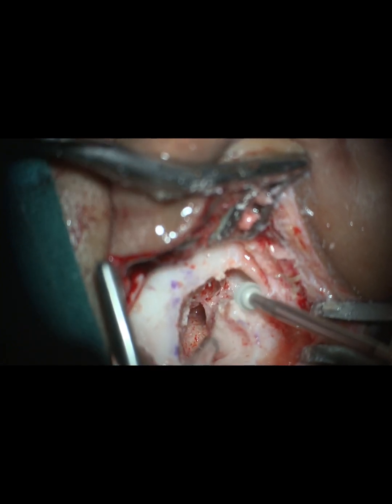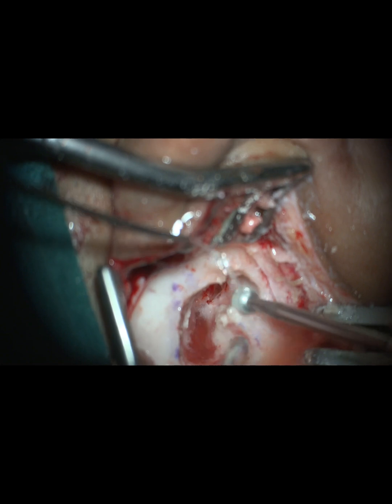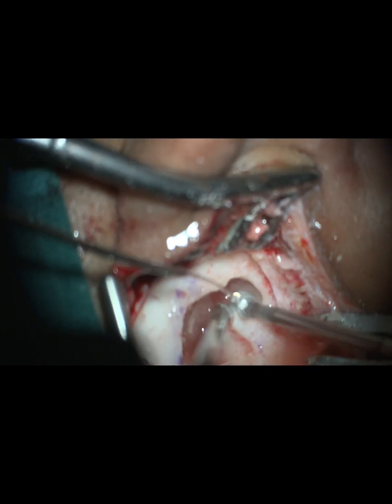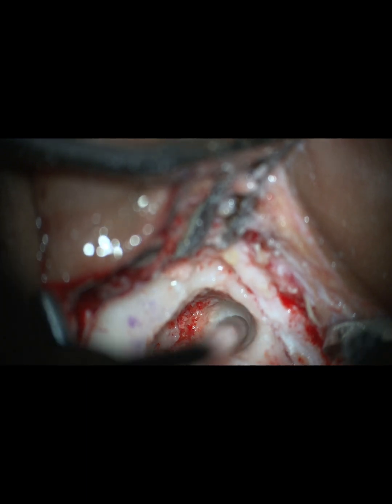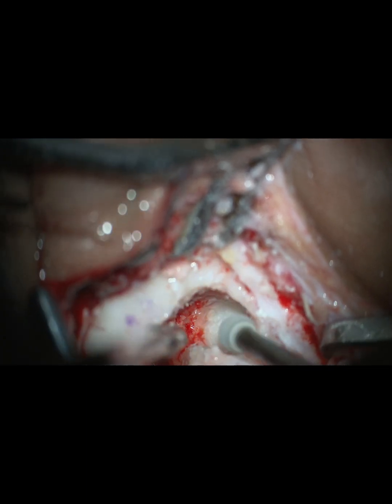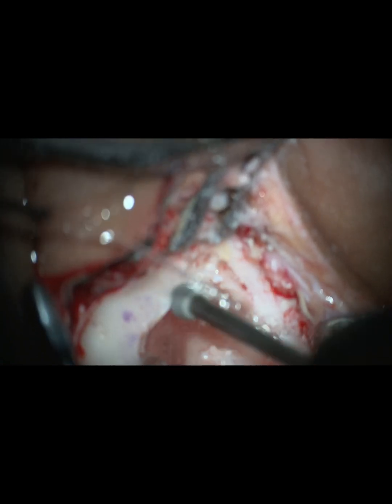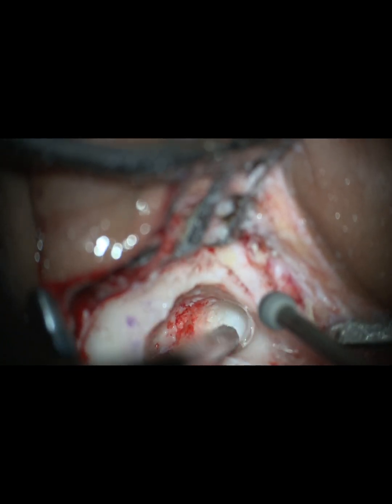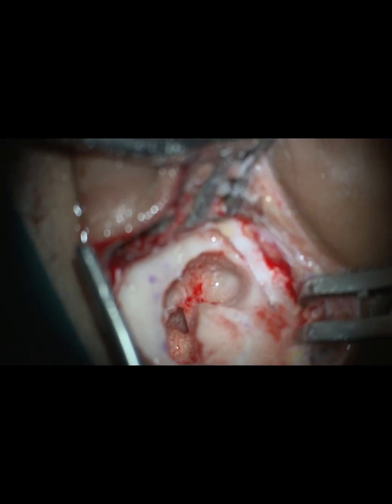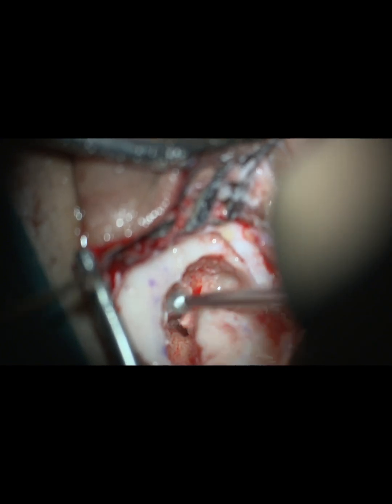The diameter of a new canal should be at least 10 millimeters. So accordingly, we dilate the opening. After thinning this atretic plate with a drill, we plan to curette, because it avoids any trauma to the intact ossicular chain and subsequent hearing loss. The bone we encountered at the region of the canal was very hard.